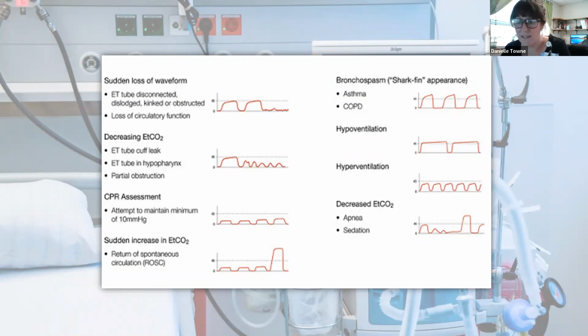You're not going to allow that end tidal to come up to 35 to 45 and be normal, right? Because that's going to make that person retain more CO2, which is going to worsen their pH, and they will code within 15 to 30 minutes, depending on how severely you cut down their minute ventilation.